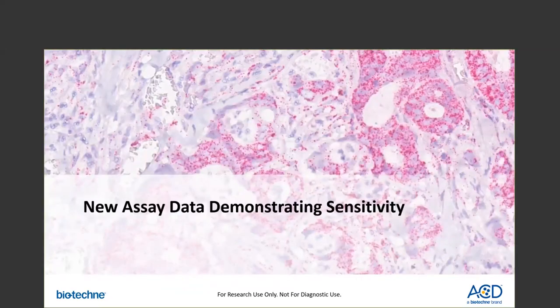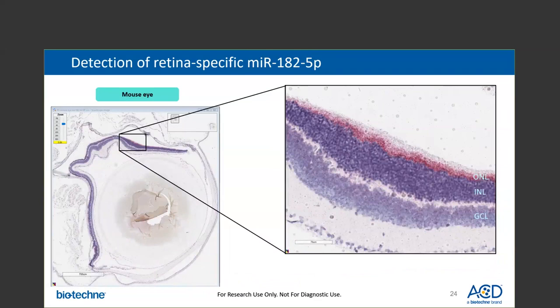Next, I'll show you a few slides to demonstrate sensitivity of our new assay. Here is an image showing the detection of outer nuclear layer-specific microRNA-182 in an FFPE mouse eye sample. As expected from published data, we can also see some negligible microRNA-182 detected in the inner nuclear layer of the eye as well as the ganglion cell layers. This demonstrates that our new assay is capable of detecting microRNAs at different expression levels across subcellular types.